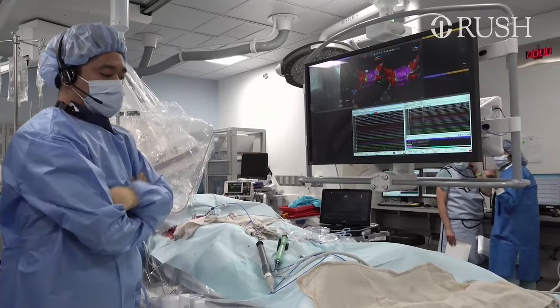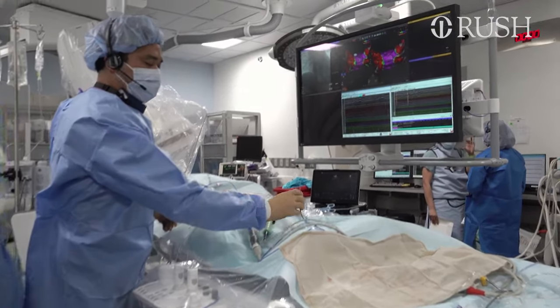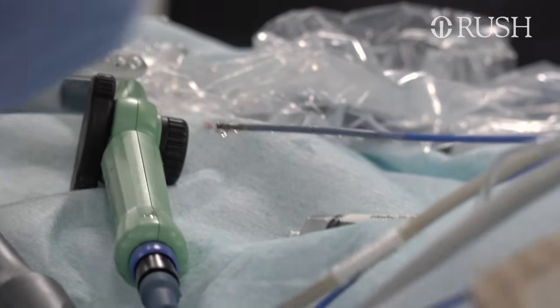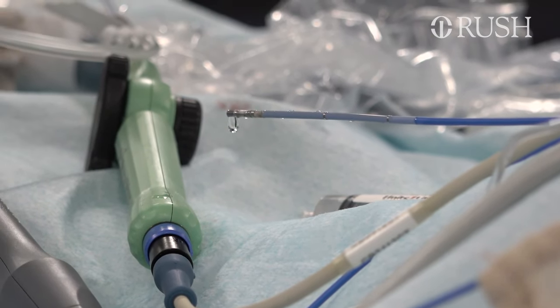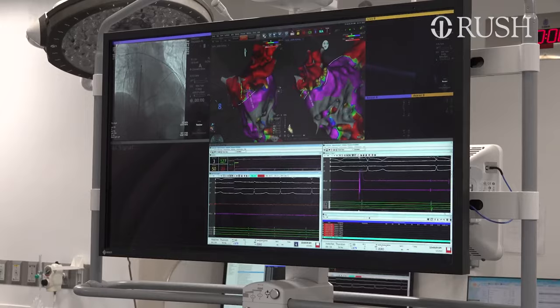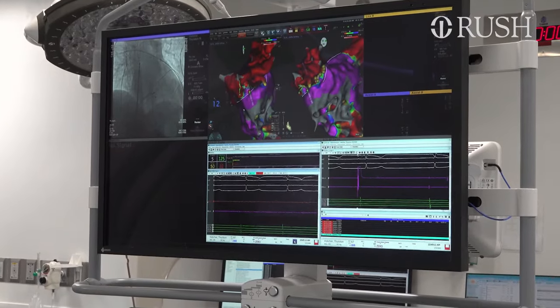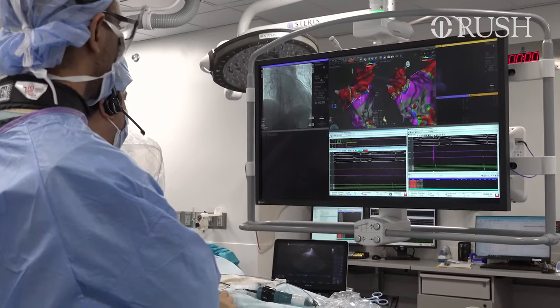So what we'll be doing is what we call a point-by-point ablation with the radiofrequency ablation catheter, which is here. It has a small platinum electrode. It's dropping fluid, which is to cool the catheter as it delivers energy so it doesn't char. Notice there are some extra heartbeats, just when we have the catheter in that area. Some interesting signals there. Just watch for any temperature rise, please.